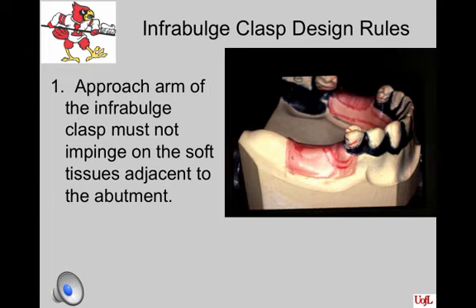Use of custom trays, viscosity of impression material, and type of impression technique used all affect whether there is a need for this relief. The custom tray with a viscous impression material may place pressure on the tissues so that the master cast reflects that pressure. The framework may come back appearing to have a space on the cast, but in the mouth it is placing pressure on the tissues and there is no room for acrylic under it. So we have used the relief.